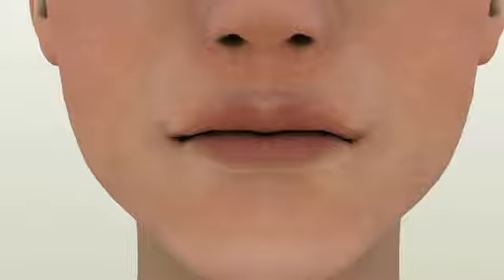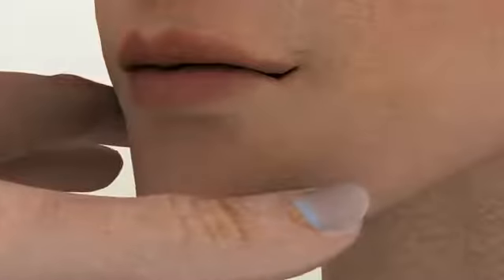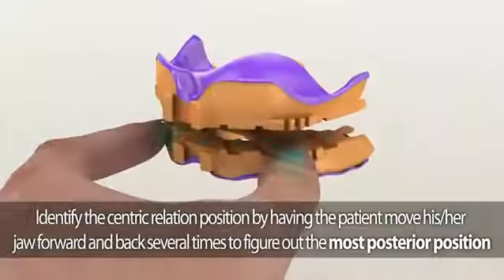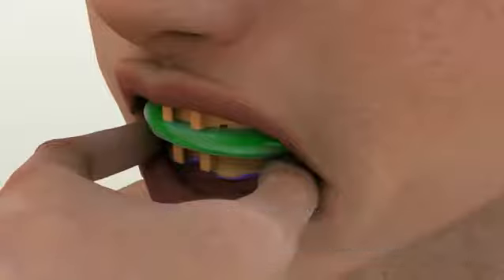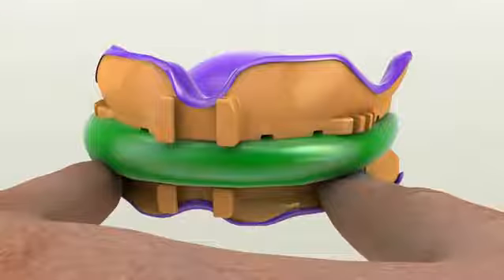Before taking the centric relation record, once you have determined the patient's vertical dimension of occlusion, identify the centric relation position by conducting a simple jaw movement. Have the patient move their jaw forward and back several times to identify the most posterior position. Once you have identified the most posterior position, inject the bite registration material in between the arms — this is the patient's centric relation location.